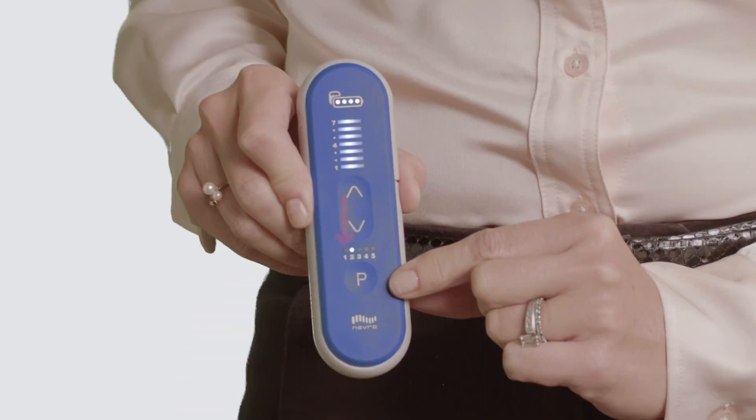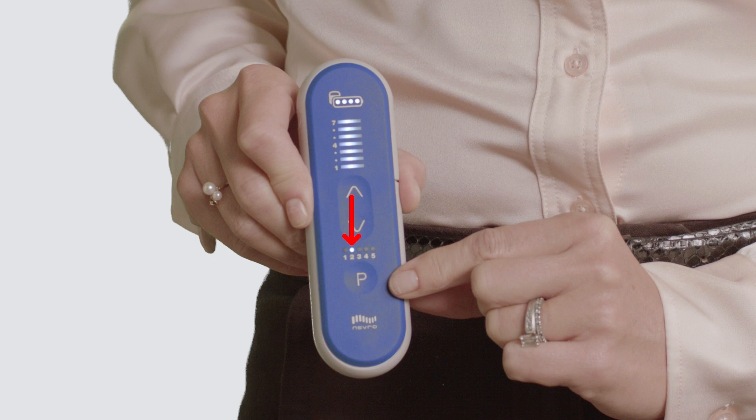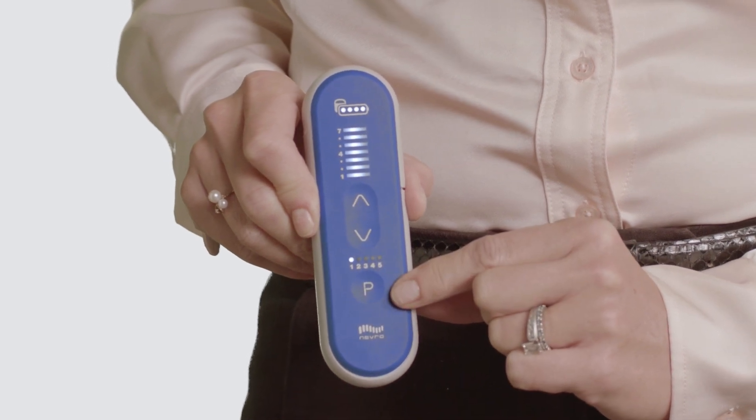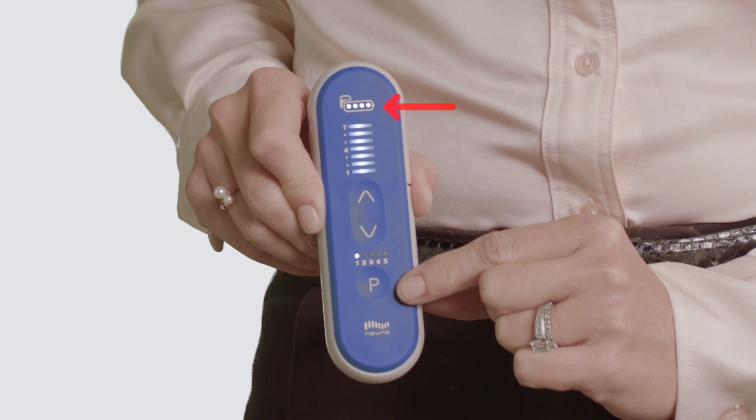Your physician or NEVRA representative might ask you to complete an impedance check of your individual leads for reasons other than an MRI. The number one above the P indicates lead one, and the number two above the P indicates lead two. Press the P button once to switch between leads and observe if all numbered levels including the battery light light up solid.